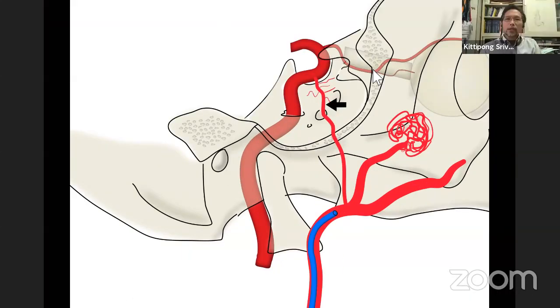In general, anything you put proximal, so if you have a lesion here, anything you do proximal, if you are too proximal and you put particles, it will enter the other arteries like this, okay? So you try to use larger particles to be safe. Yeah, it can be safer, but you cannot predict how large this channel is. Sometimes they say it's 150 microns, but it can be even larger than that.